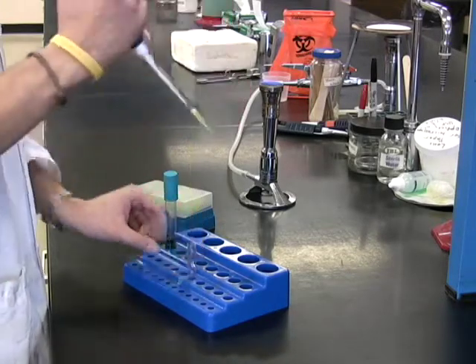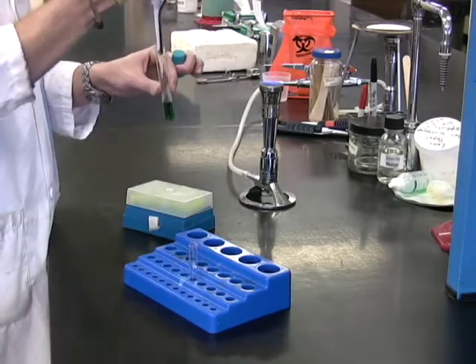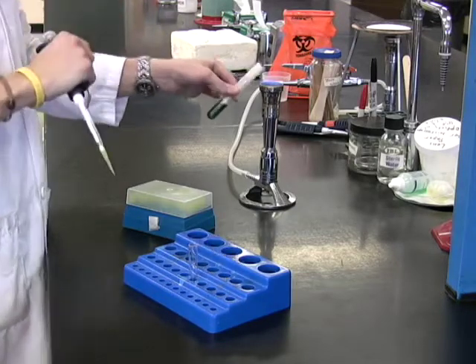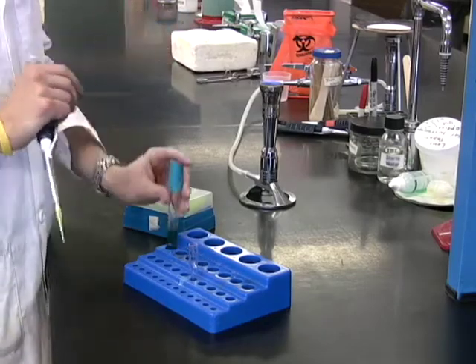Next, pipette 0.2 milliliters of saliva into the tube. After you have done this, you can mix the contents of the tube by tapping it on the bottom or rolling it between your hands. Allow the tube to harden and place it in the incubation bucket.